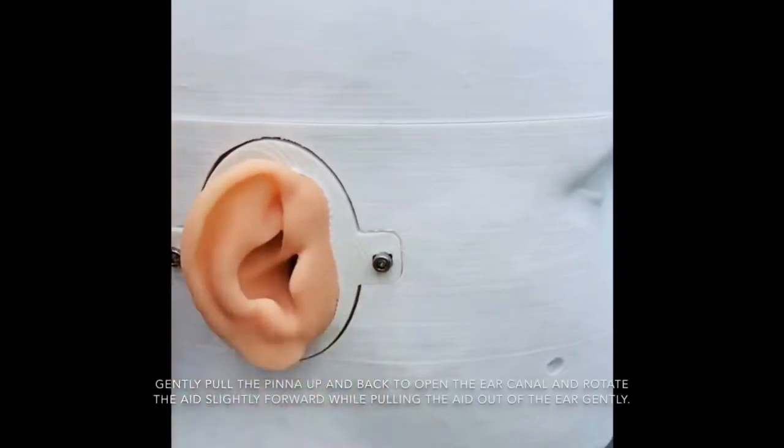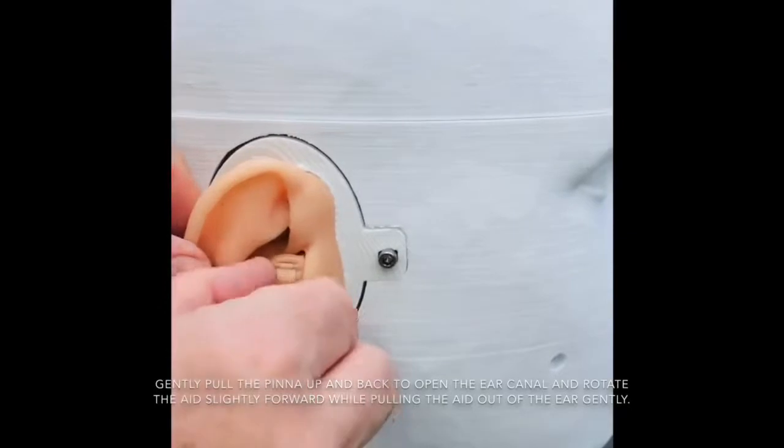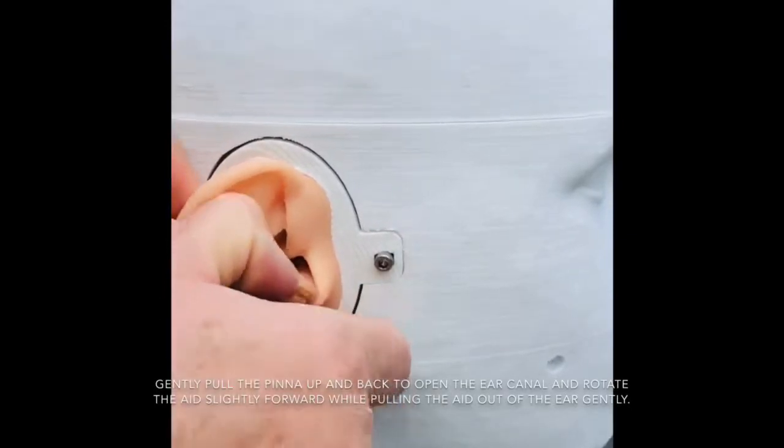Gently pull the pinna up and back to open the ear canal and rotate the aid slightly forward, while pulling the aid out of the ear gently.